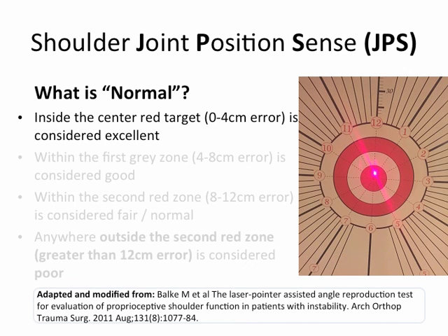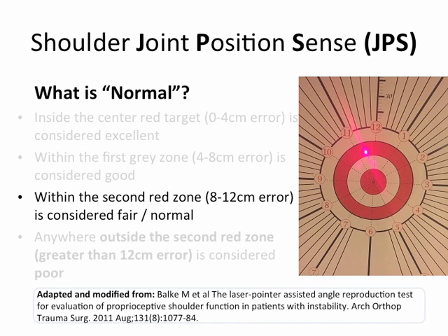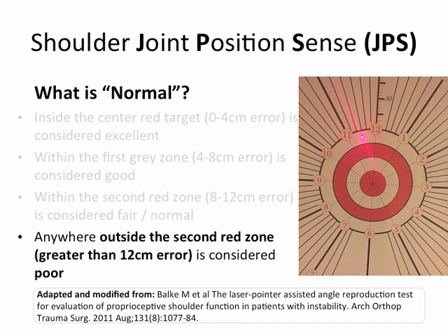So what is normal? If they're inside the center of the red target — 0 to 4 centimeters of error — it's considered excellent, as seen in the image on the right, though this doesn't always happen. If they're within the first gray zone, 4 to 8 centimeters of error, that's considered good. If they're within the second red zone, 8 to 12 centimeters of error, that's considered fair or normal, which is the most common scenario. If they're anywhere outside the second red zone — greater than 12 centimeters of error — that is considered poor.